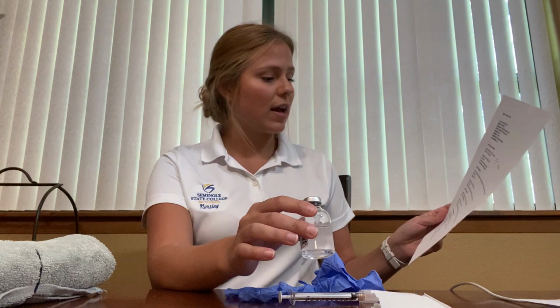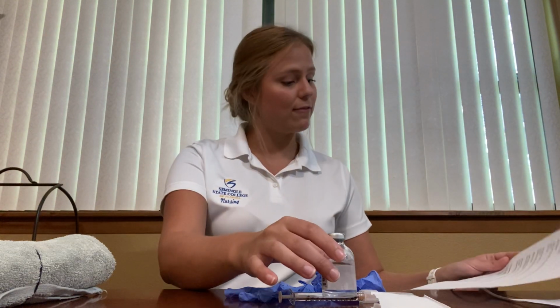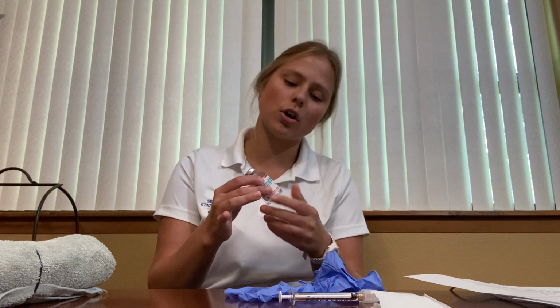And then I'm going to go to the med room, retrieve my meds, and this is where I'll perform my first check. So I have the right patient, Anna Pawlowski, right drug, B12, amount, 500 micrograms, route, subcutaneous, and time, 1500. And then I will be having to do a calculation. And I'm going to check the vial for the expiration date, so May 2029, so it's still good.